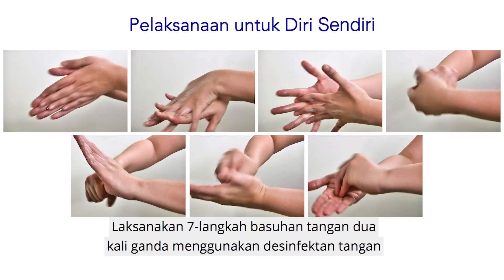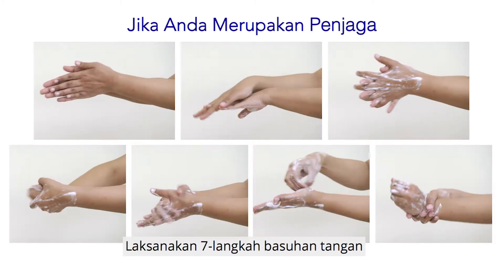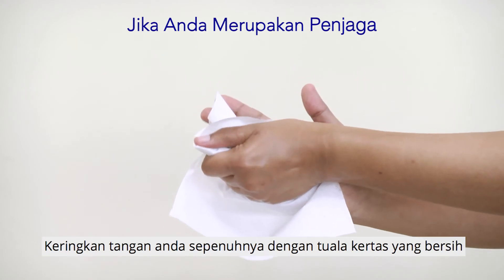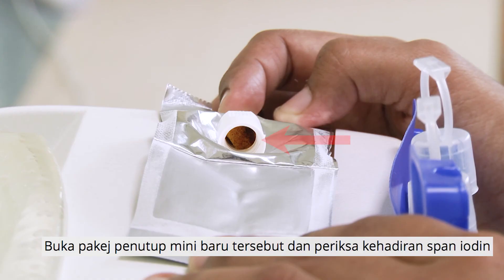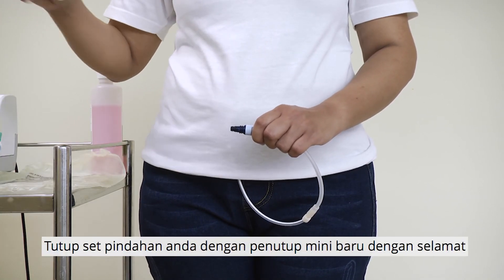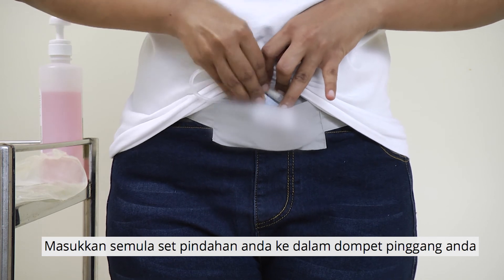If you are performing the therapy yourself, perform a double 7-step hand rub using the hand disinfectant. If you are a caregiver, perform the 7-step hand washing and dry your hands completely with a clean paper towel. Open the new mini-cap package and check for the presence of the iodine sponge. Remove the patient line from your transfer set. Close your transfer set with the new mini-cap securely. Put your transfer set back into your waste pouch.